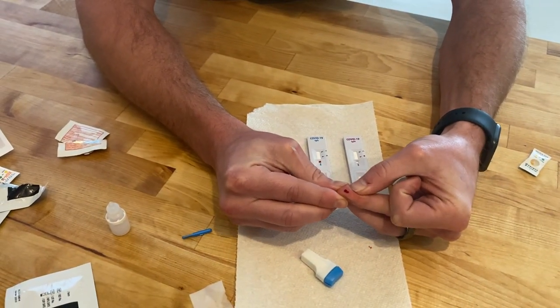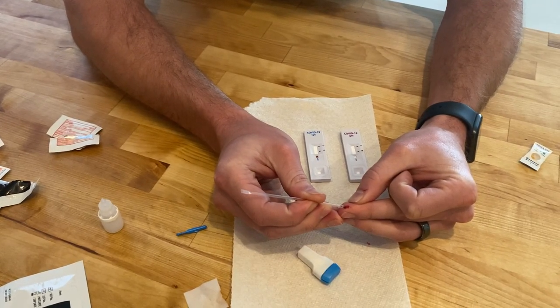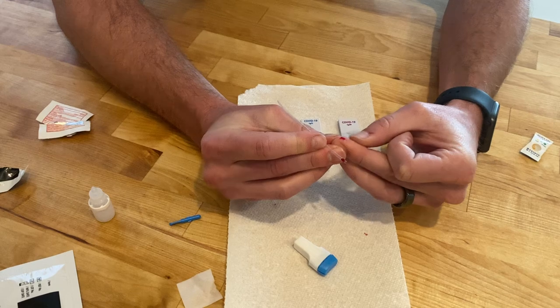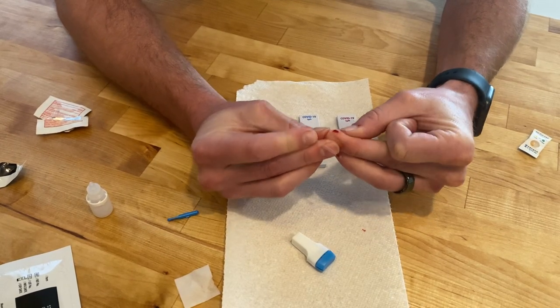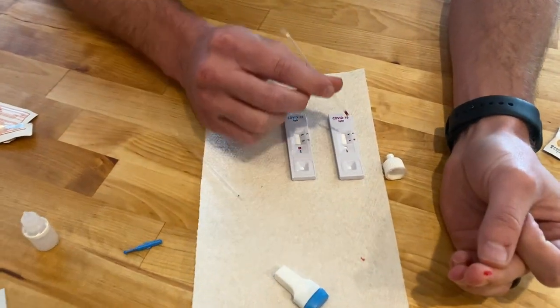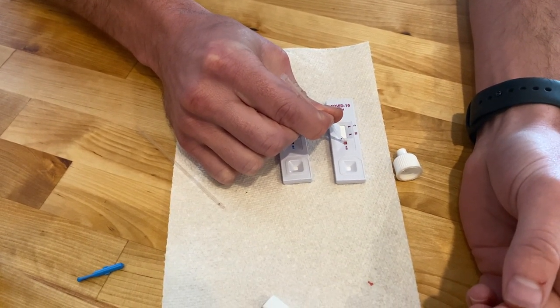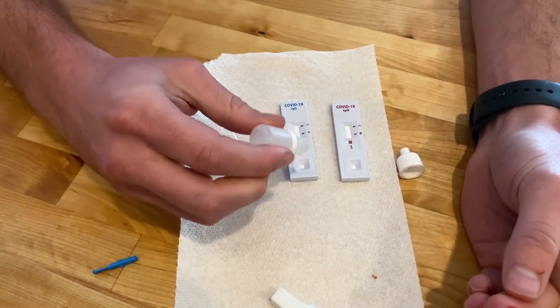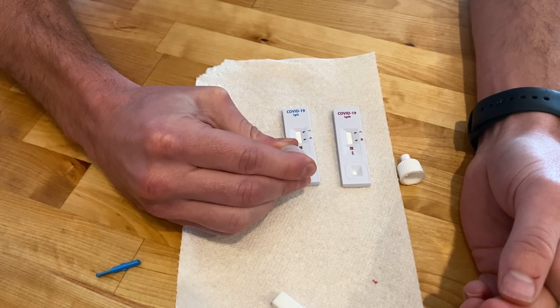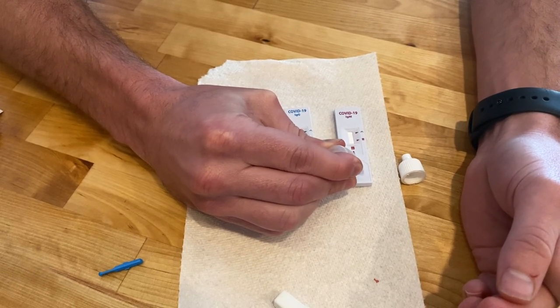You can use a separate tube for the other test kit. If you get a large enough pool of blood on your finger, you can probably fill both from one stick. Once you've got it to the black line, put it in the sample portion of the second kit. Now apply the buffer — you need three drops on each kit: one, two, three on the first, and one, two, three on the second.